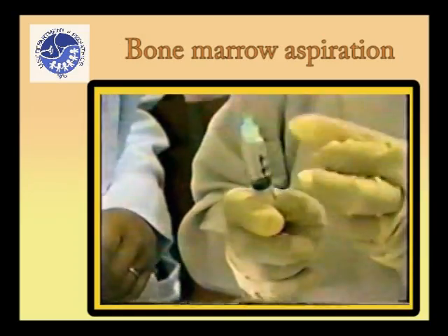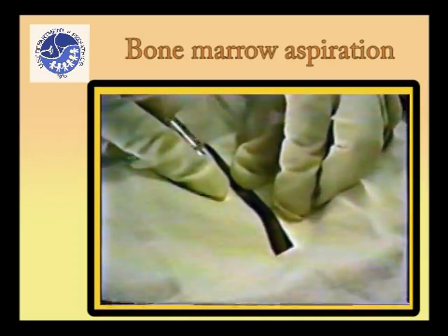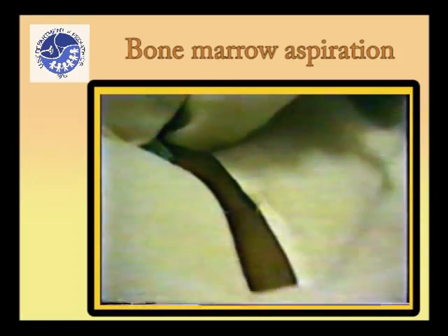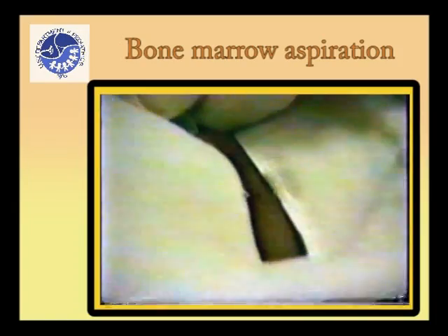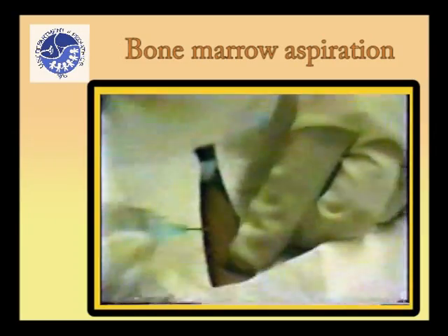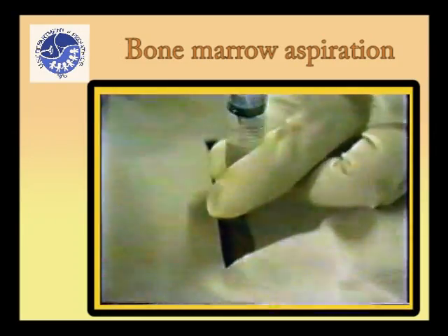Start the procedure by locally infiltrating the skin and periosteum using 2% lidocaine solution. Infiltrate the most superficial layer of the skin, then advance the injection needle until it touches the bone and again inject the anesthetic. The total amount used should not be more than 5 milliliters.